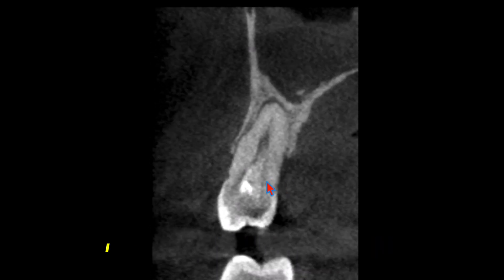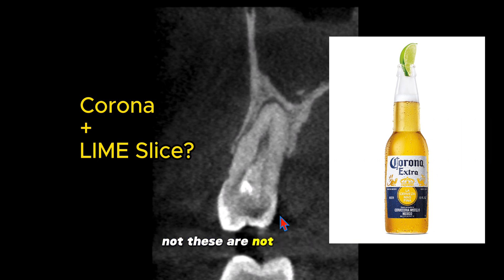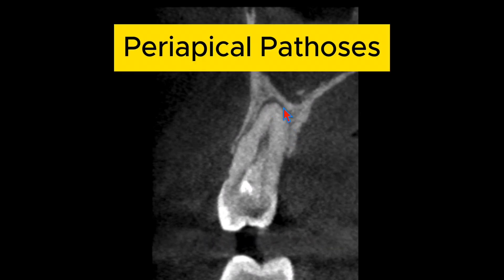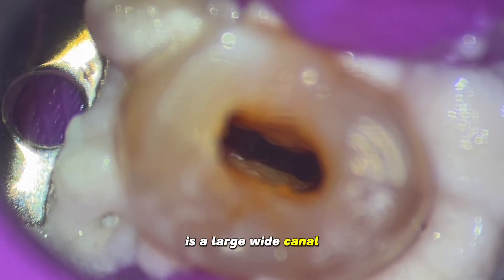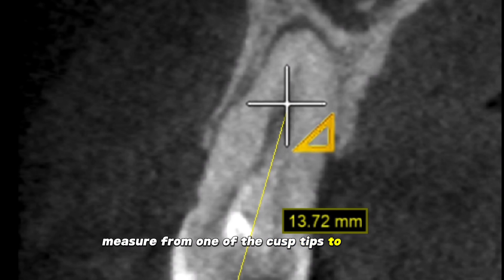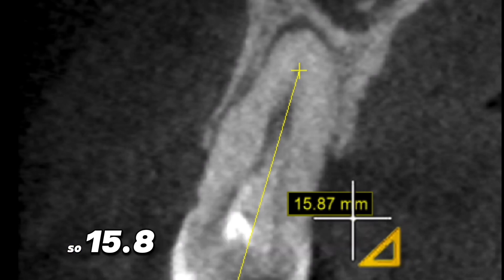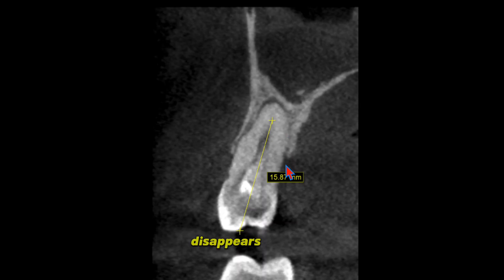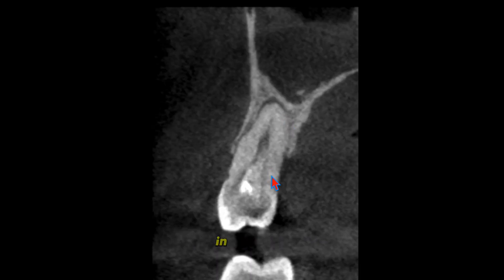First of all, on the coronal slice, we can see we have two canals — or is it one big one? Things we look for with cone beams: first, we have a small lesion and probably a large wide canal. I've done the case, so I can tell you — it is a large wide canal. One of the first things we can do is measure. From one of the cusp tips to where the canal disappears is about 15.8, almost 16 millimeters. Why is it disappearing? That tells me it either bifurcates in different directions and planes, or it's just a big curve. In this case, it's a large curve.